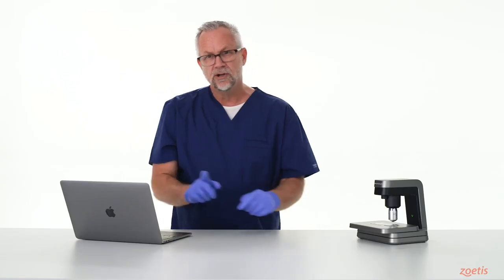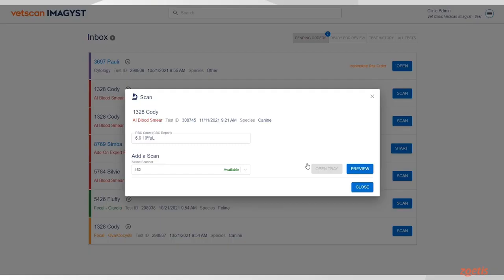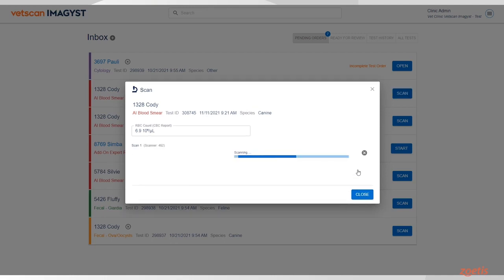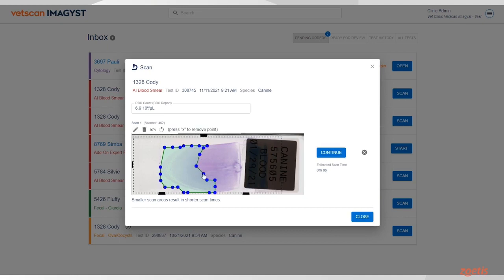Return to VetScan Imagist and click on the Preview button. When the preview appears, review the suggested scan area and estimated time to scan. Adapt if necessary by moving one of the blue dots to a different position.